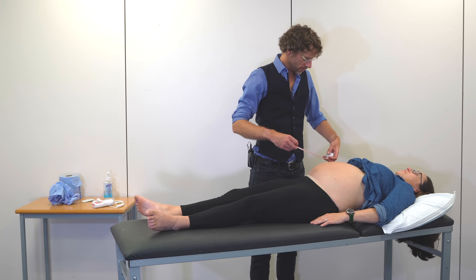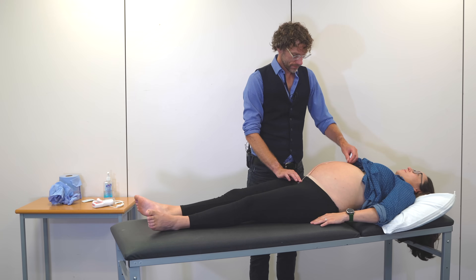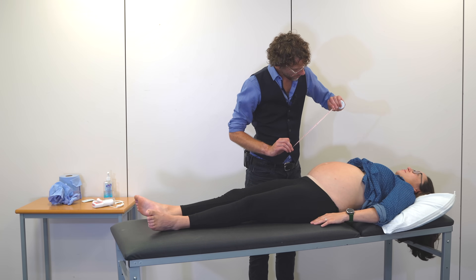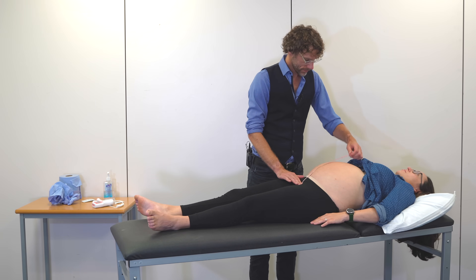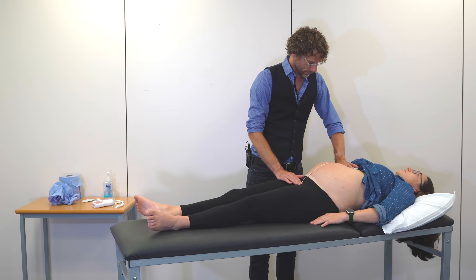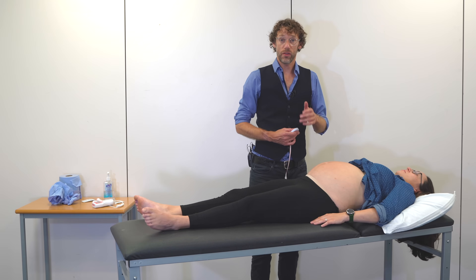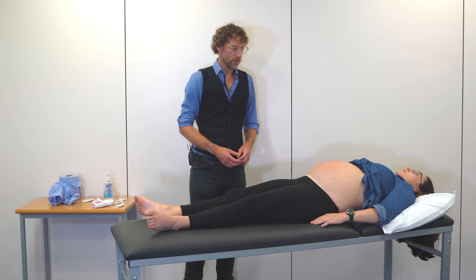We're going to do that three times. Pressing the symphyseal fundal height and pressing across — I've got 34 centimetres there. And once more — again 34 centimetres. So we're going to take the larger of those measurements, 34 centimetres, which we'll now plot on the growth chart.